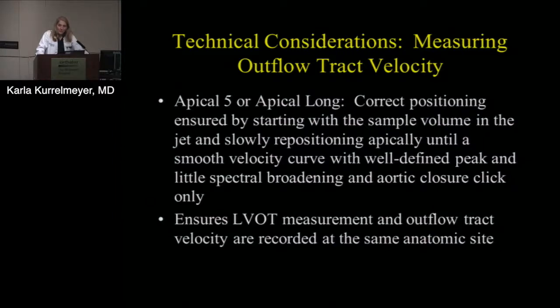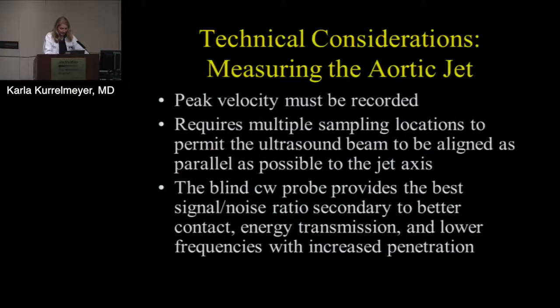If you don't do that, if you're way too far in the left ventricle, we're going to overestimate the severity of aortic stenosis. If you're way too far on top of the valve with an opening and a closing click, we're going to underestimate the severity of aortic stenosis. So both of those are very, very important to make sure that we get the correct aortic valve area.